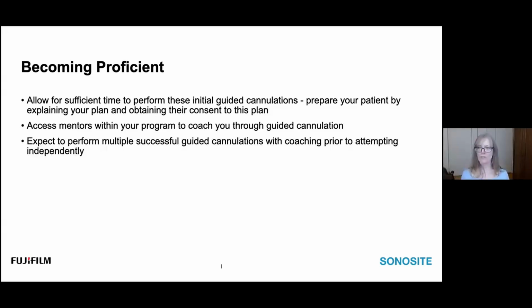Reach out to all the resources you have access to answer your questions. And expect to perform multiple successful guided cannulations with coaching prior to performing independently, if you have that luxury in your program. Whenever possible, ask somebody to coach you through.